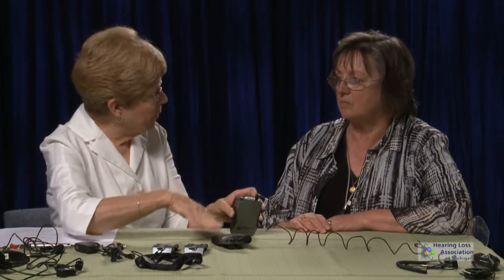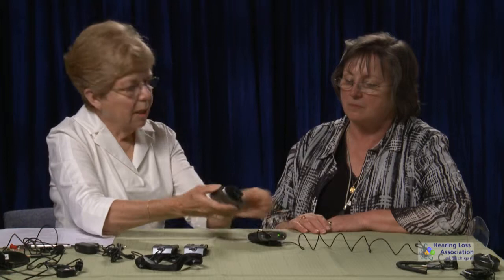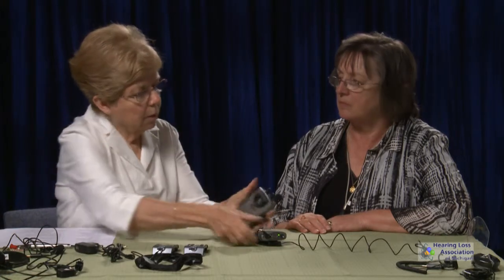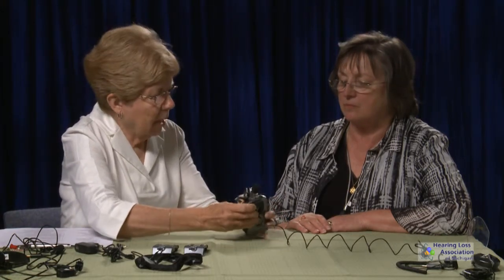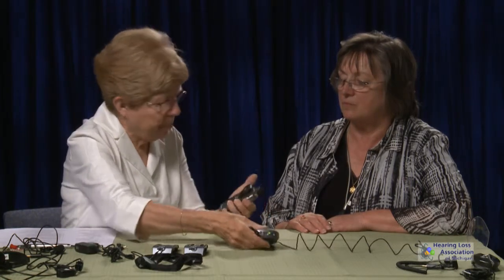This particular device works on radio frequency bands that have been set aside by the federal government for their use. And you have to have the transmitter and the receiver on the same channel. Now, the neat thing about this is if you were to go to a conference and they're using an FM system in several different rooms, and you've got your receiver here, you have a way to tune to the same channel. With the transmitter, the tuner is on the top.